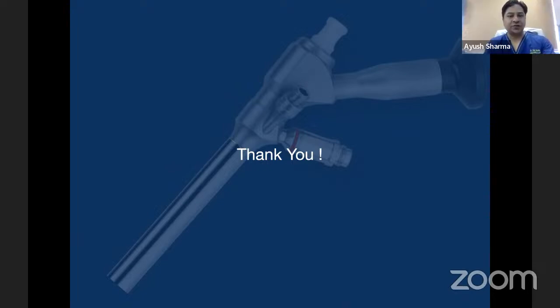Thanks a lot. So, thank you, Dr. Datar, for the excellent talk. When you revise your own endoscopic surgery, do you find it challenging? Or is it much easier compared to when you have revised an open surgery? No, endoscopic surgeries are easy to revise, I would say, because the planes are very well maintained. If you're looking at transforaminal revision, it is much easier because we don't find much scarring. For the interlaminar approach, the scarring is very limited. So you may always go cranial and caudal, identify the normal margin of the bone and the soft tissue, and from there start your dissection downwards towards the scar. So transforaminal is the easiest revision you can do. Interlaminar is a little bit more difficult than transforaminal.